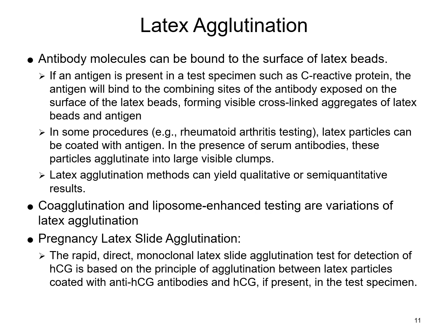With any of these methods, especially your latex agglutination methods, usually you can do a qualitative test or a semi-quantitative test. With your qualitative test, again, it's got that L in there, so it's a letter: positive or negative. Versus semi-quantitative, where you would use some serial dilution, and it's actual numbers. You're looking at what point is your last positive reaction. This will be where you would report out that rheumatoid factor as a 1 to 8. Once you reach your 1 to 8 dilution, that was your last positive.